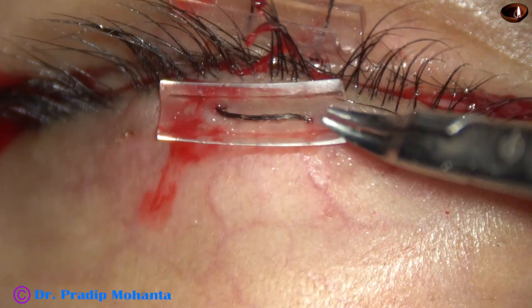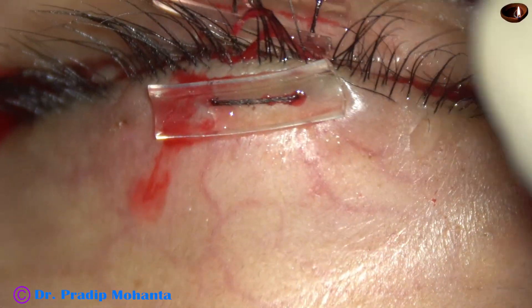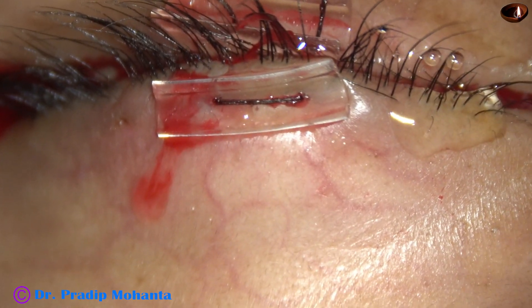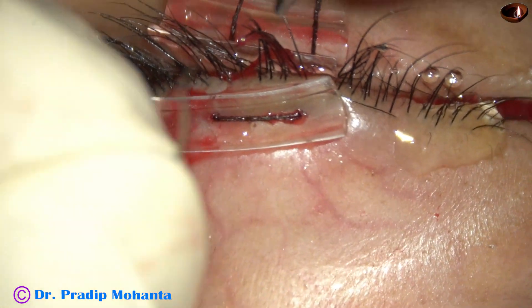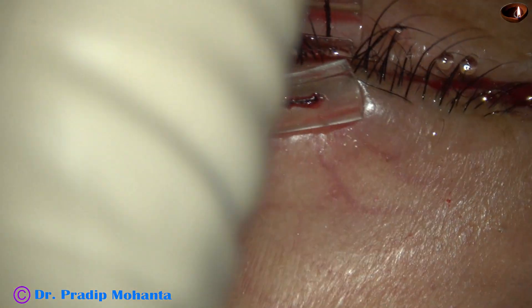We have to oppose these two eyelids very nicely — there should not be any gap. If there is a gap, new tissue cannot grow and the two eyelids cannot get adherent to each other. So the two raw surfaces have to be nicely opposed.